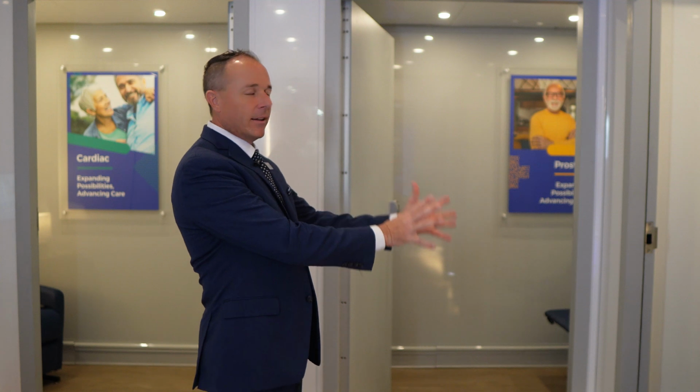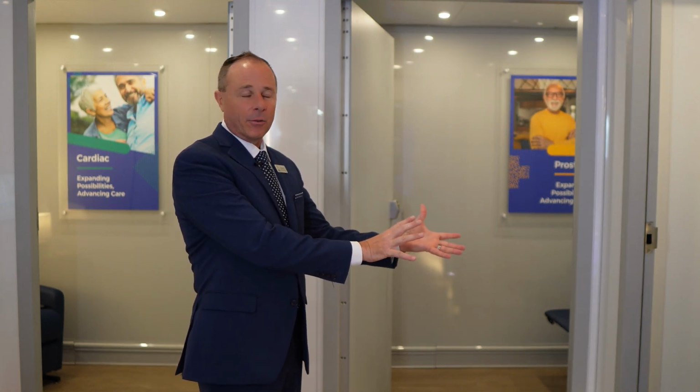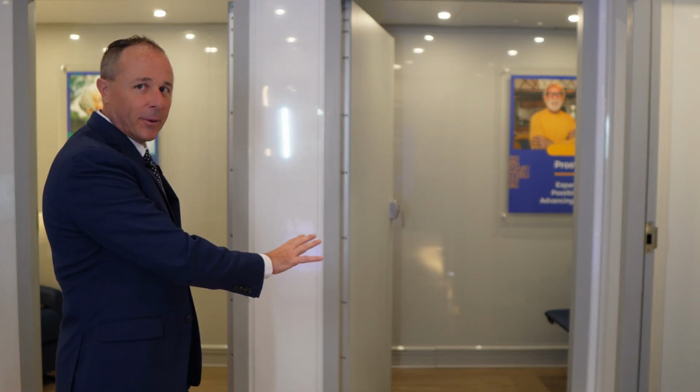So in a PET CT case, we have a hot lab, which is necessary. If we were to add a bathroom, we would plumb this to the hospital for a bathroom as well. And then as we think about really helping patients have the best experience, they have their injection and then they rest in an uptake room. And here we have 3 uptake rooms. So this greatly increases our productivity and our ability to treat more patients.